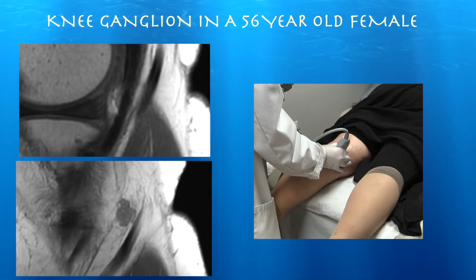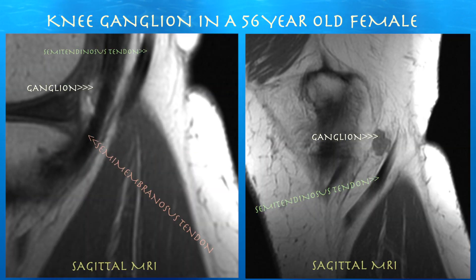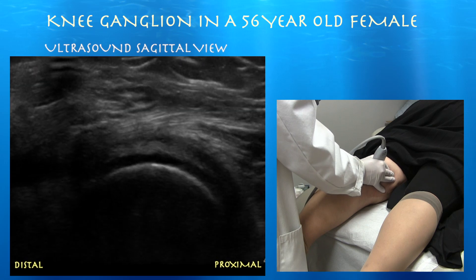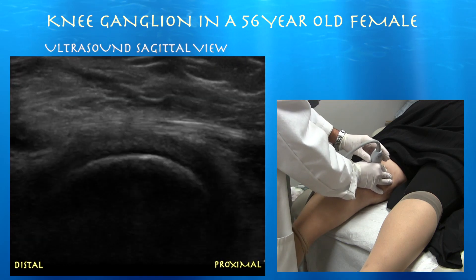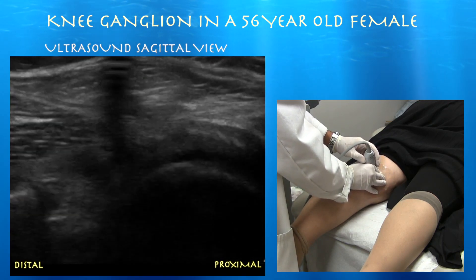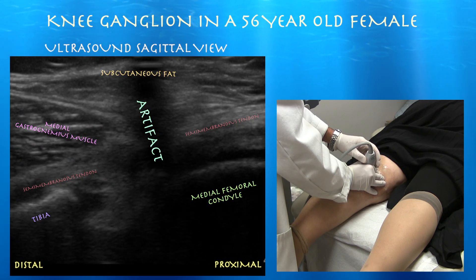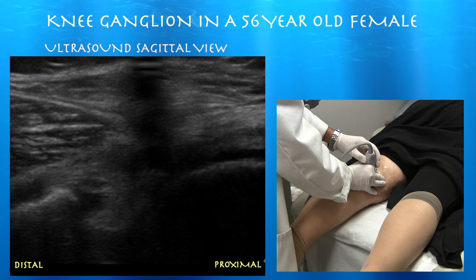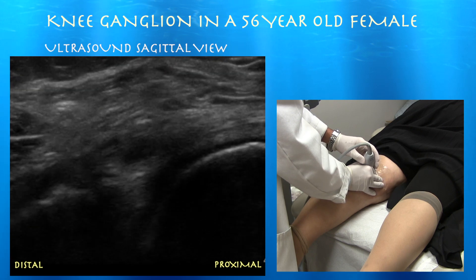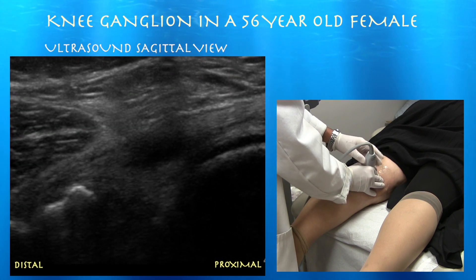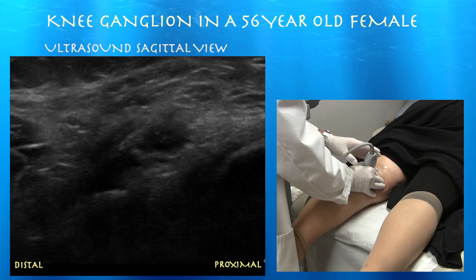Here we're zoomed in on this ganglion — you can see that it basically abuts right into the subcutaneous fat on the sagittal MRIs. We've got our semimembranosus muscle on the right and bottom, so let's follow that tendon again, keeping the probe flush. Here you can see the medial gastrocnemius muscle, and here you see artifact caused by the crease within the popliteal fossa — you don't want to mistake that for a cyst. Here we're toggling and getting a good look at the semimembranosus tendon, whose distal aspect appears dark secondary to anisotropy.